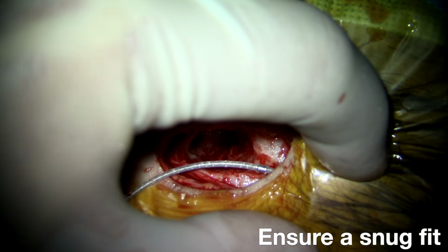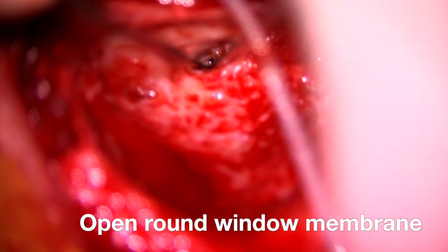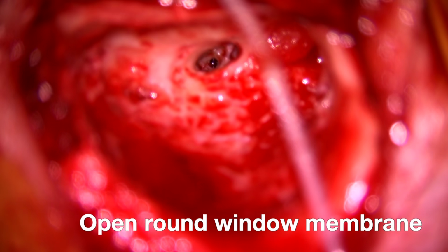With the device in place, you're ready to open the round window membrane. Ideally, you'll wait to open the round window membrane until after the implant is placed to avoid blood and other debris getting inside the cochlea, which can impact hearing preservation. First, we'll demonstrate the lateral wall electrode placement.